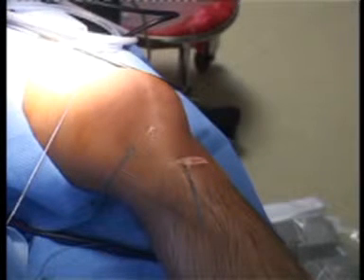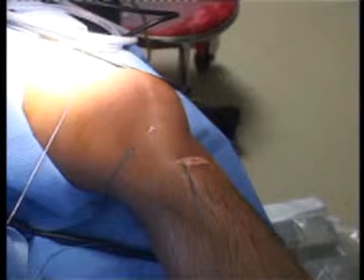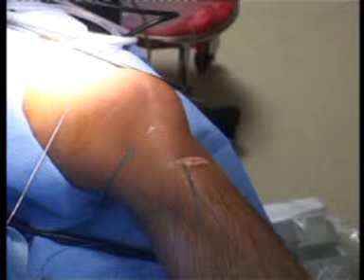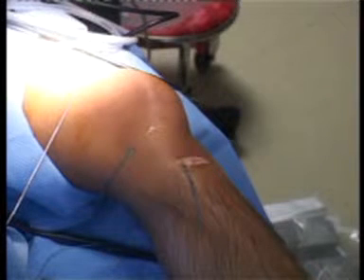When I saw the procedure, I asked them, what do you do for your athletes? And Dr. David Dejour told me that this guy is an Olympic level javelin thrower for France. So this is what we do for our athletes. No fixation in the femur, and just one single screw in the tibia. A very well done press fit bone plug. So that's what the French people do.